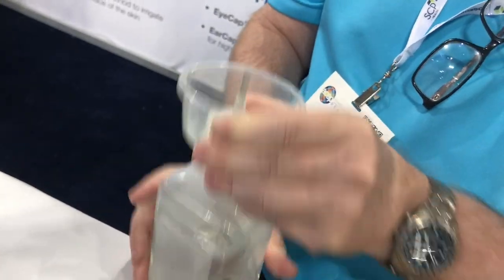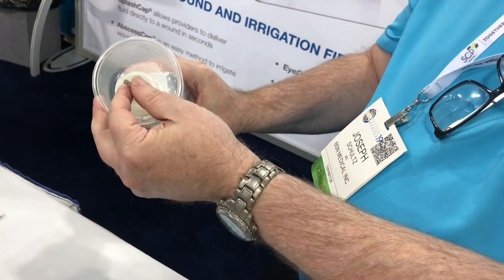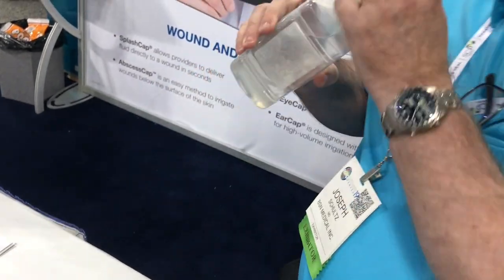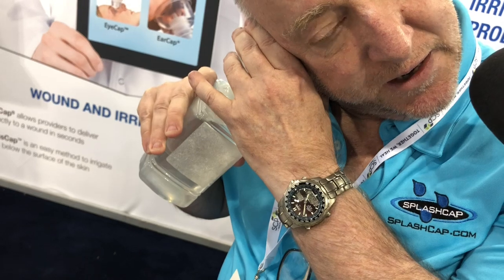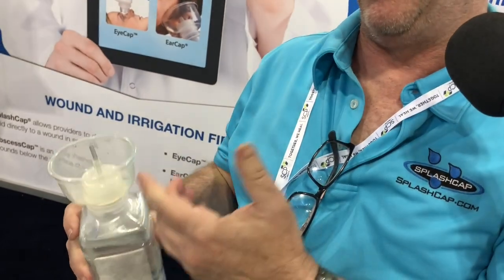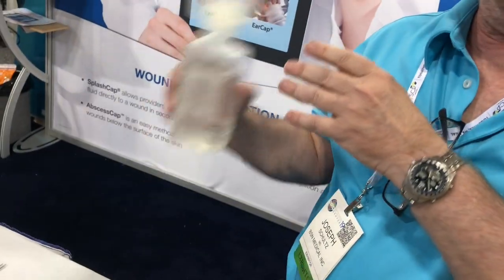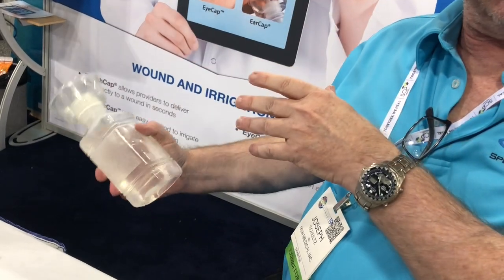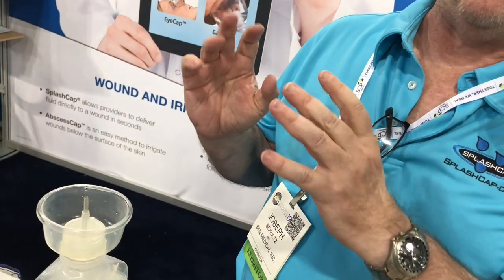You're going to put the — it's eccentric, kind of like me. So you're going to put the short side closer to the ear, then put this in the ear against the surface and irrigate. Fluid will flow up into the ear, and then gravity will pull it down, and you've got a catch basin right here. You squirt, dump it in the sink, squirt, dump it in the sink — just do that repetitively. It typically takes about 200–500 mL of fluid to get enough to remove some of the cerumen.